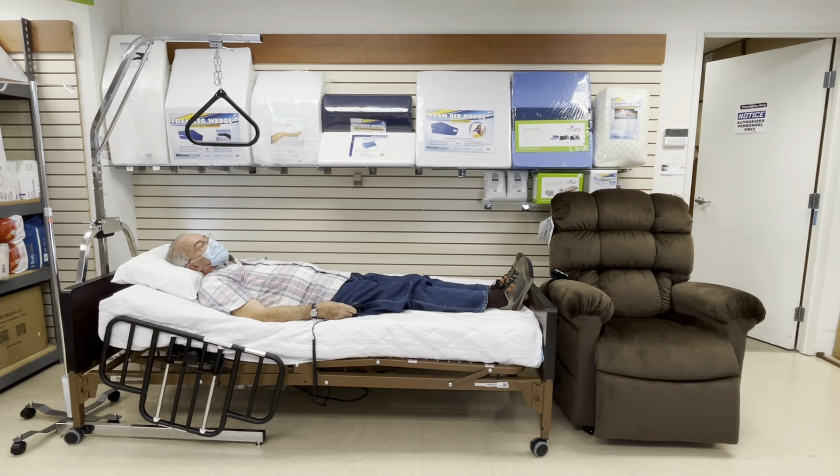This is a semi-electric bed in which the backrest and legs are adjustable as well as the height of the entire bed. It includes four lockable casters located on the corners of the bed, along with adjustable side rails and an electronic hand control.